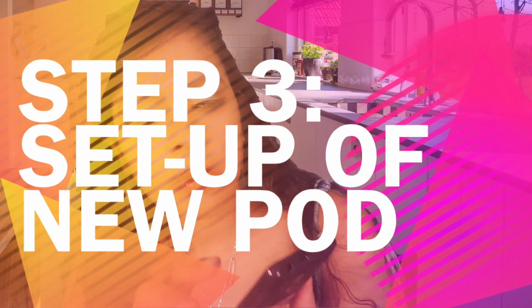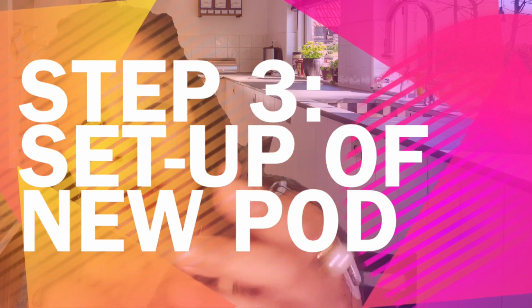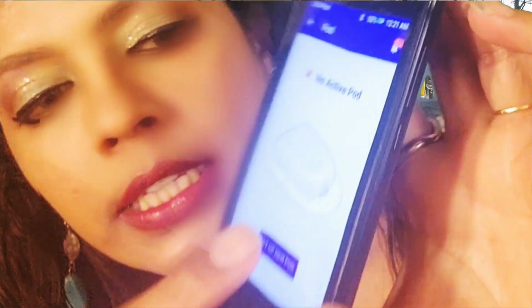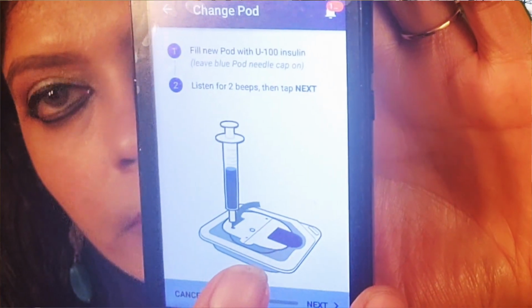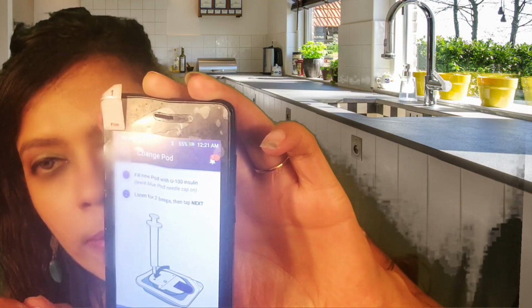Okay guys, so I have deactivated my old pod, I've taken that off, and now I am going to be setting up the new pod. So can you guys see this? It says no active pod, set up pod. So just click on that, then set up pod. It will tell you to put insulin into the pod. This is my new box, it's a pack of 10.